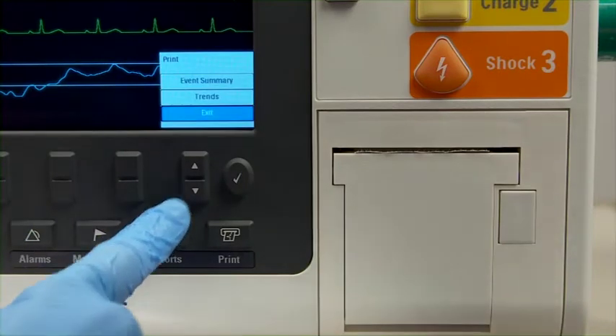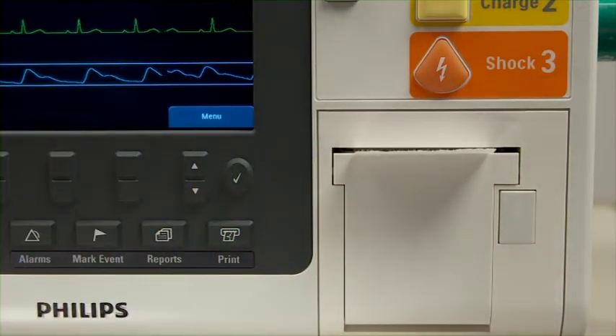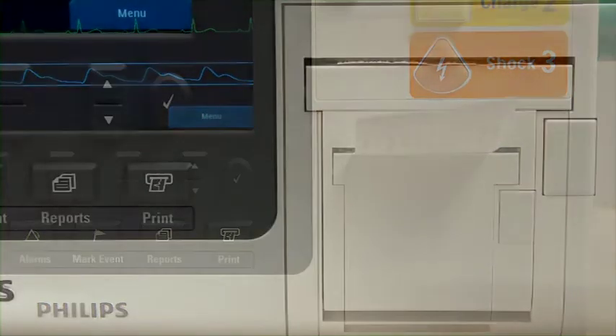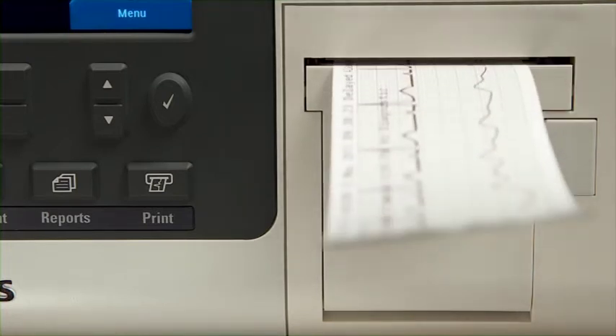Press this button to activate the reports menu, where you can print either an event summary or trends report. Press the Print button for a continuous printout of the primary ECG and a second wave with event annotations and measurements.